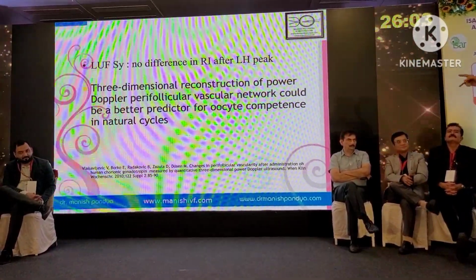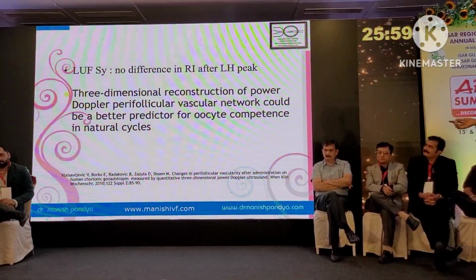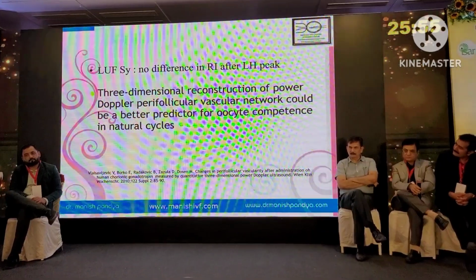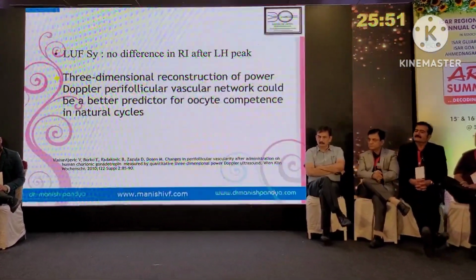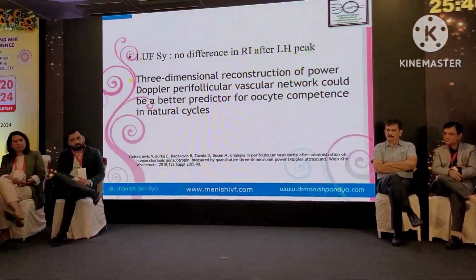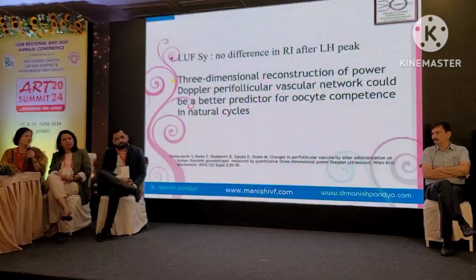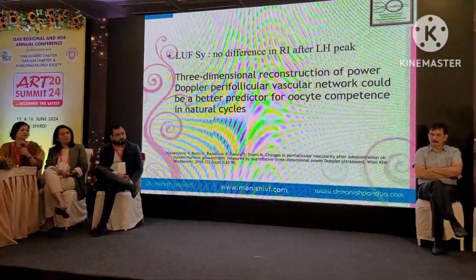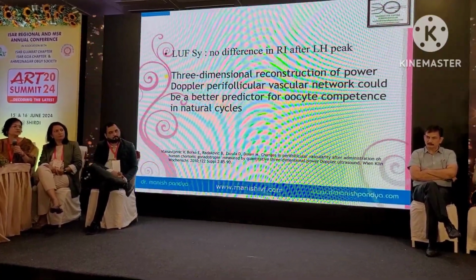Okay. Now, Nidhi, you are doing 3D reconstruction. What is your role? Suppose in this type of situation you are confused whether the 3D reconstruction of Doppler follicular vascularity can give you a very good idea. You are doing sono AVC and like this, we can do it, and it will definitely help. But if I talk about my practical take-home points, I'm not doing 3D reconstruction for all follicles. But in a special situation, like a 24 mm follicle with 20 PSV, now you are confused.